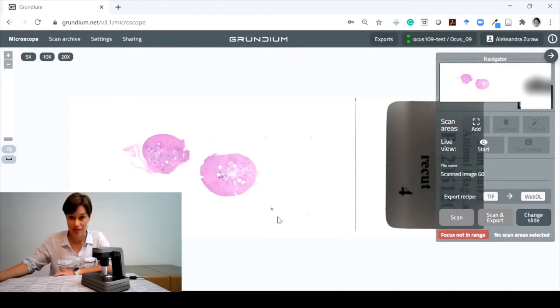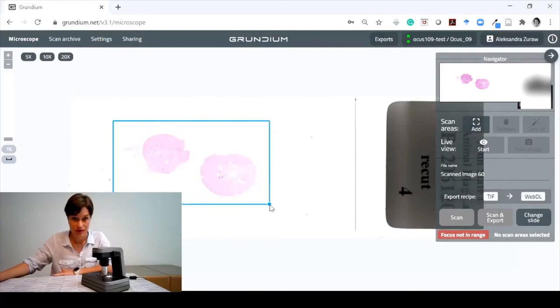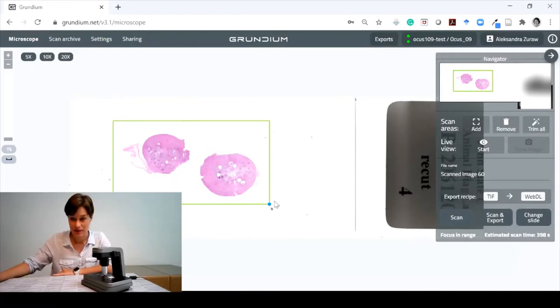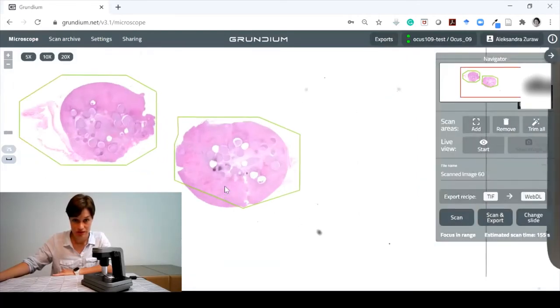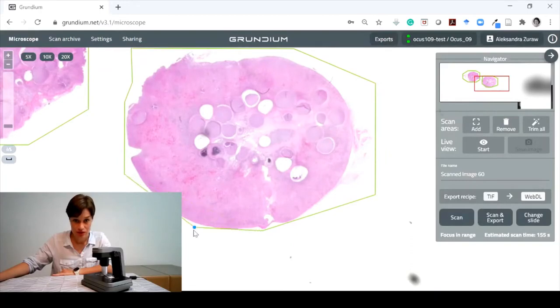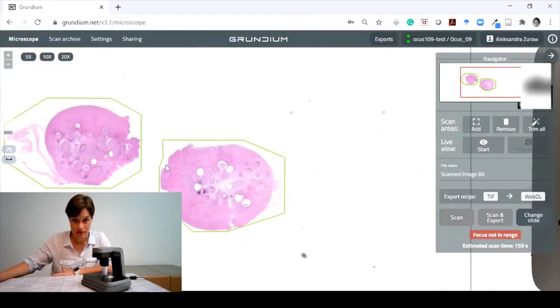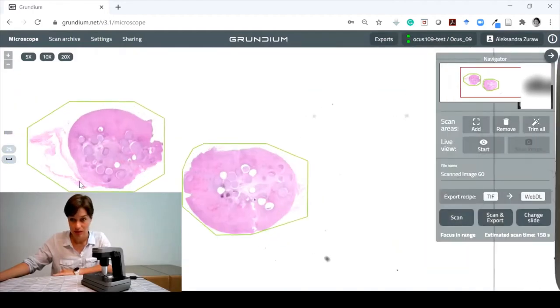The first thing we want to do is add scanning areas. We don't want the whole white space to be scanned. So we're adding scan areas. We have this blue dot and we mark the scan area. But we can refine it even more by clicking trim all. It's trimming these tissue pieces automatically, and we can obviously adjust it if it's not perfect. We can adjust however we want, but this looks pretty good.